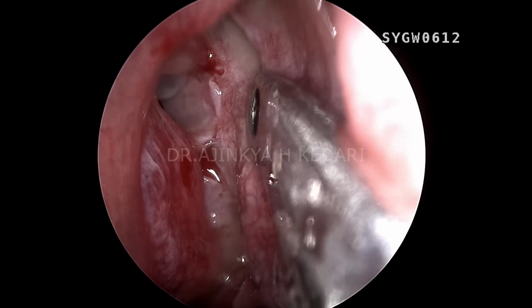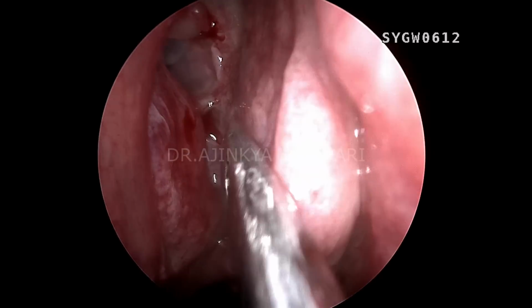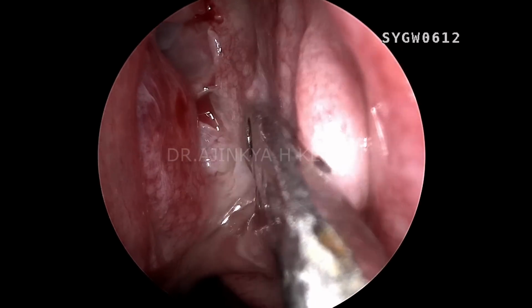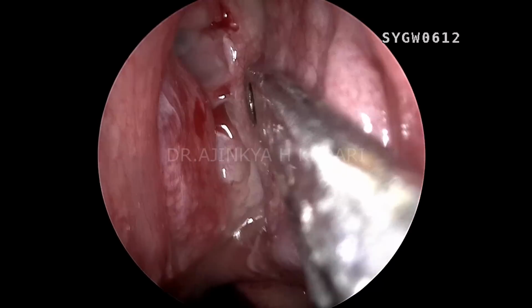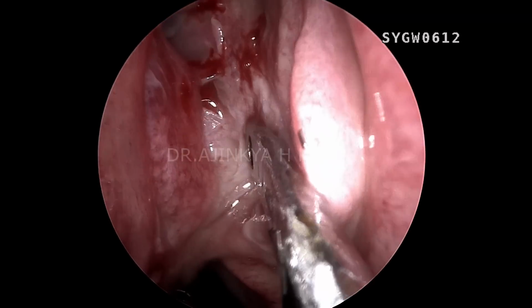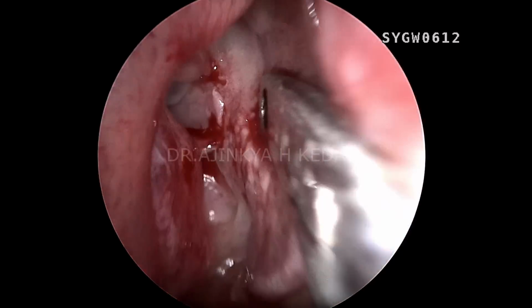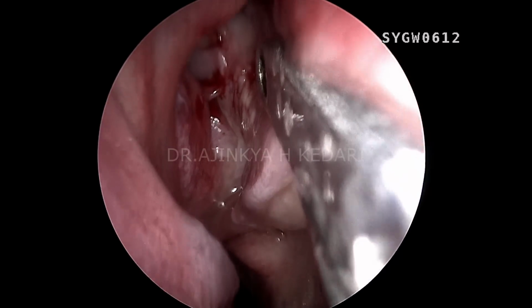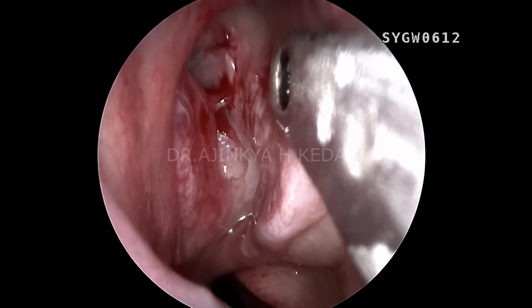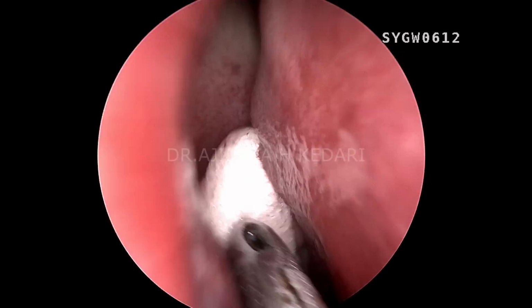So that's the middle turbinate. I'm trying to microfracture it right now by medializing it along the septum. I can actually feel the micro crackles happening. You can see there's hardly any capillary ooze because I'm using the blunt surface of the shaft of the suction Freer and not the tip. If you use the tip of the Freer, it's going to cause mucosal bleeding.